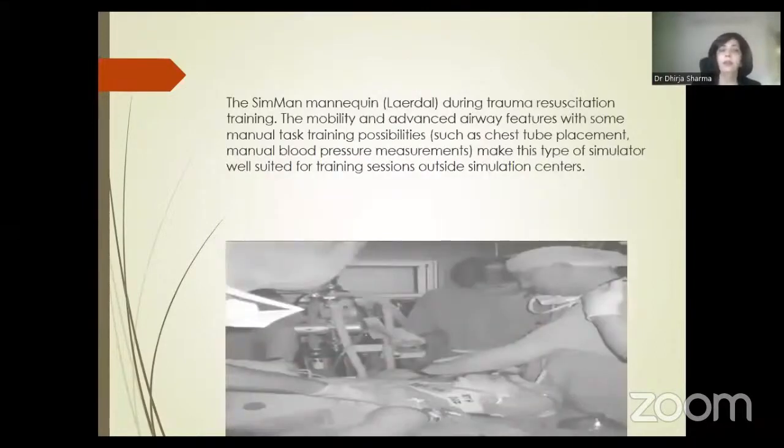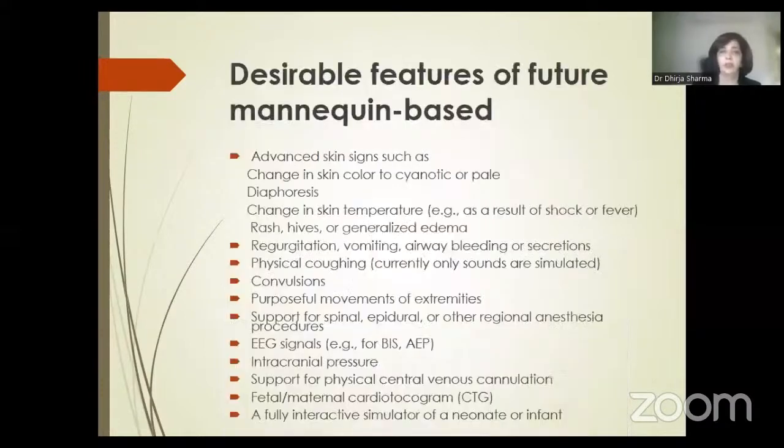The SimMan mannequin during trauma resuscitation training, this is what we are using. The mobility and advanced airway features are there, and we can even put in chest tubes and do manual blood pressure measurement in the patient, to make this type of simulation well suited for training sessions outside the simulation centers.